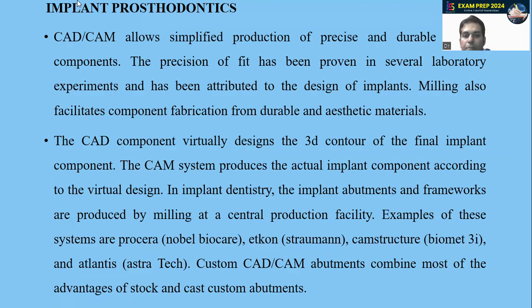In implant dentistry, the implant abutments and frameworks are produced by milling at a central production facility. Examples of these systems are Procera by Nobel Biocare, Etkon by Straumann, the CAM structure by Biomet 3i, and Atlantis by Astra Tech. Custom CAD CAM abutments combine most of the advantages of stock and custom made abutments.